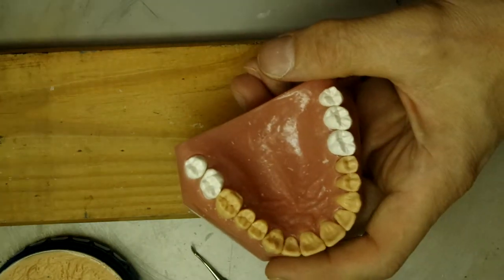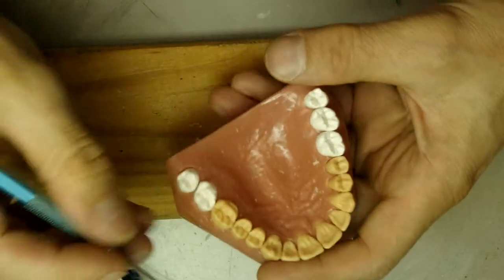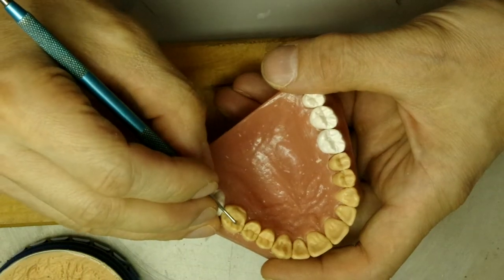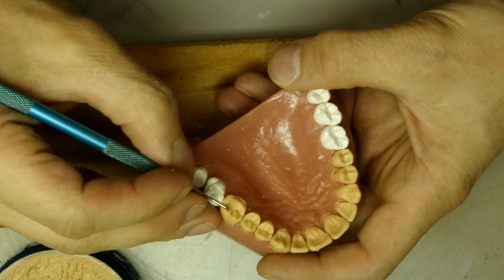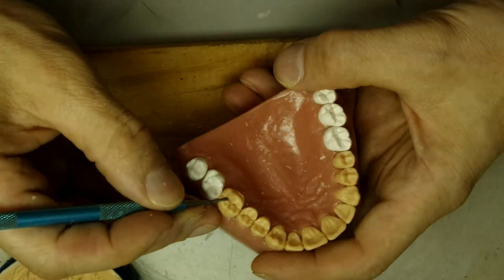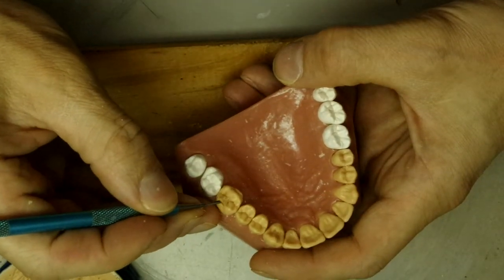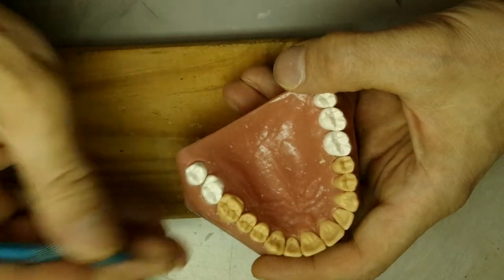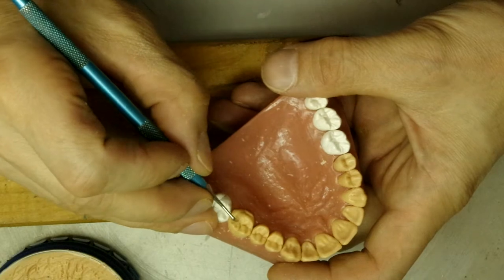We can use the instrument to define the central grooves and the developmental grooves that break through.